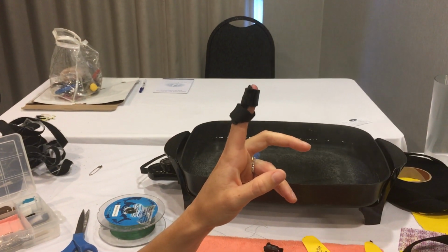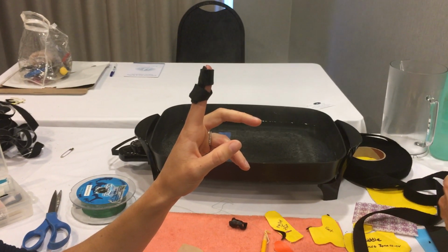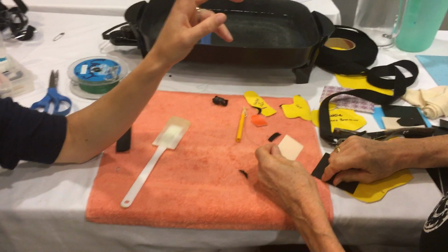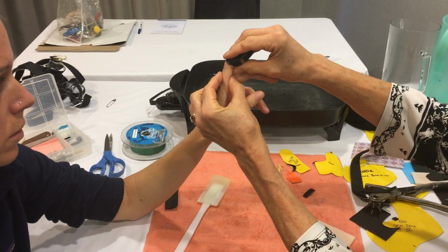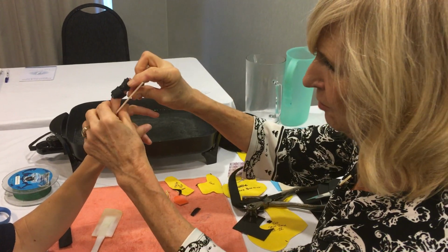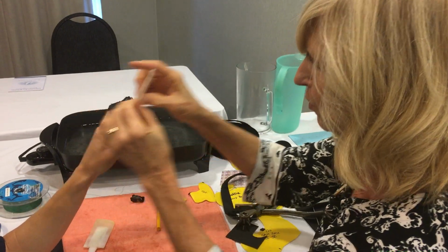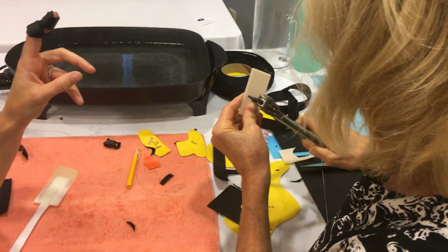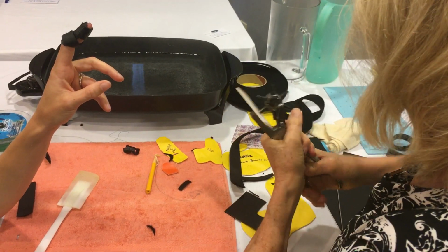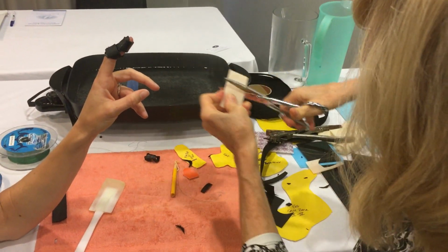So now we're going to try to make that modification that will hold the PIP joint in flexion, because it's now recommended that we hold the PIP joint at 30 degrees of flexion for the first 3 weeks. And so what I want is thermoplastic volarly, push the finger through, and then the top of the thermoplastic is going to hold the finger in flexion. So I basically want to put a hole right around the level of your PIP joint line. And then this doesn't need to be as long as I made it, so I'm going to cut this off. So it's almost like a square with a hole in the middle.